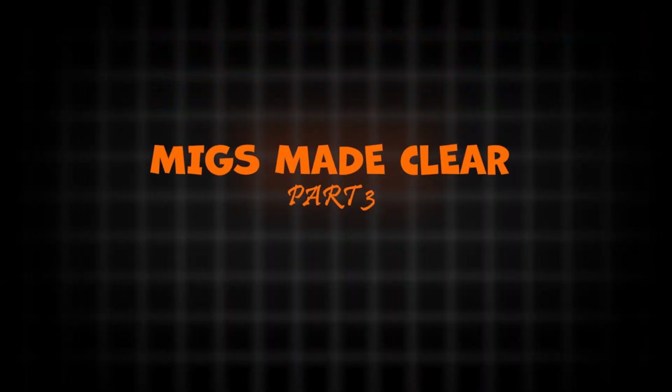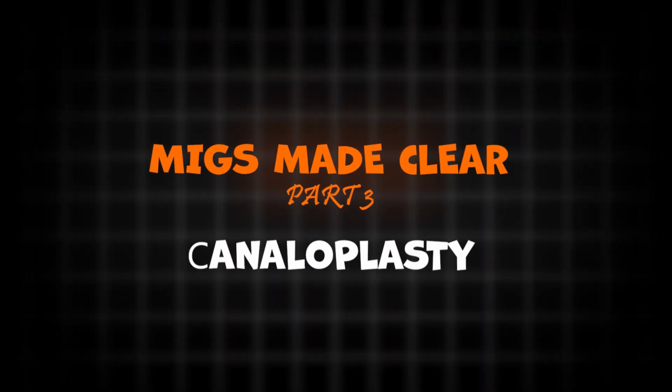Today, in this Part 3 video, we're going to talk about canaloplasty, or viscodilation techniques and devices that perform them.